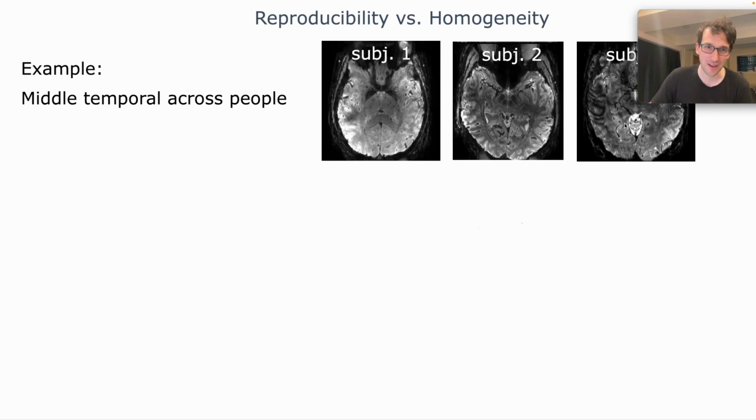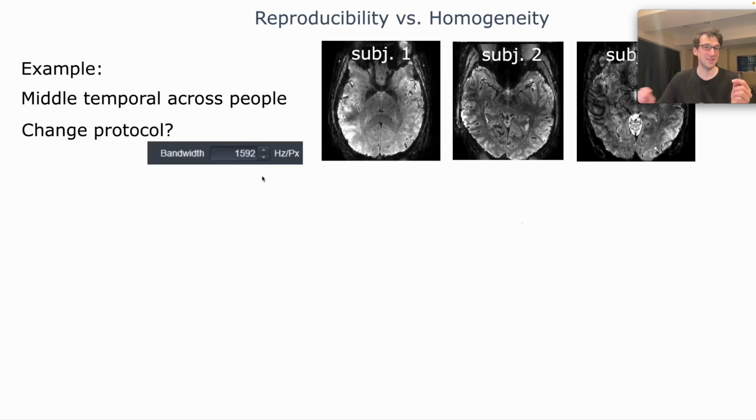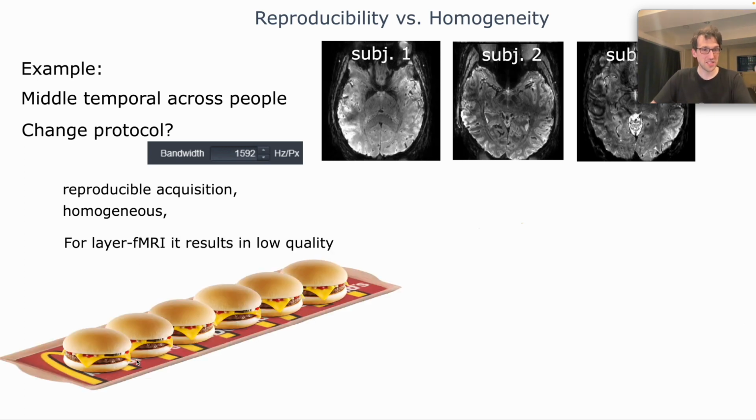And those are low spatial frequency ghosts, and we have maybe acoustical resonances or mechanical resonances. So you could easily account for that by lowering your bandwidth, right? Do you do that? There are some people who think absolutely, of course, we want to have a reproducibly high quality of the data, and some people say no, this is like changing it. You cannot. And so there is this conflict of really having a reproducible acquisition with the identical parameters, which might end up with low quality, but the same parameters.